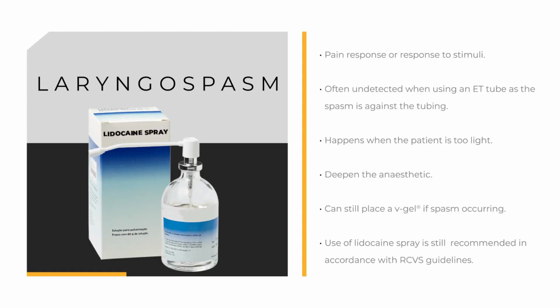Laryngospasm. Even though the V-gel does not touch the larynx, laryngospasm can still occur, as this is often as a result of a pain response as well as to stimuli. This occurs quite frequently during anaesthesia, but often remains undetected when using an ET tube, as the larynx spasms against the tubing. A laryngospasm can only occur when the patient is too light. It does not happen when the patient is fully unconscious.